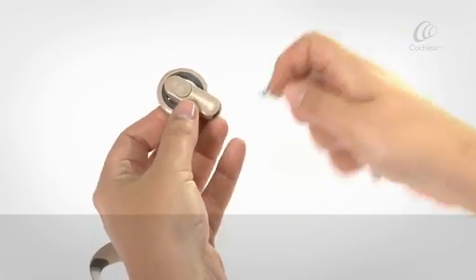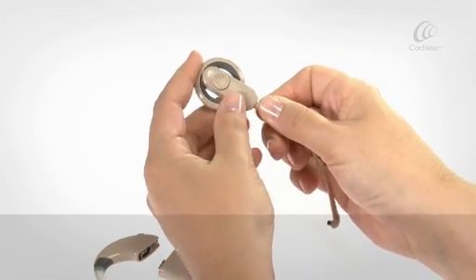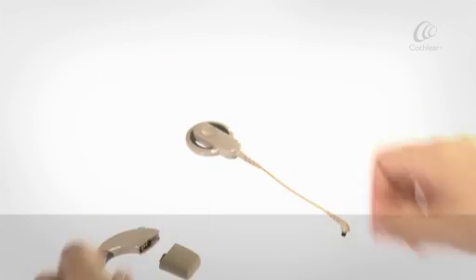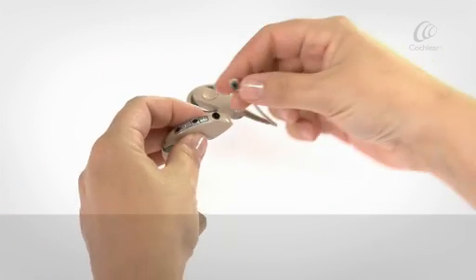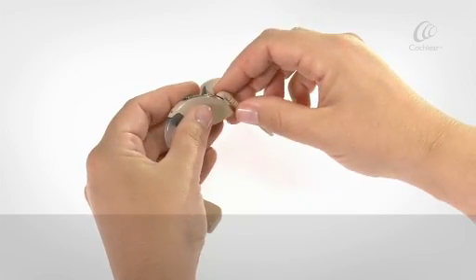Push the coil cable into the coil until it clicks into place. Push the other end of the coil cable into the processing unit until it clicks into place.